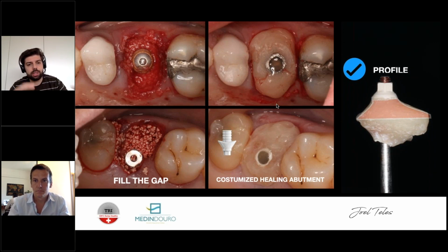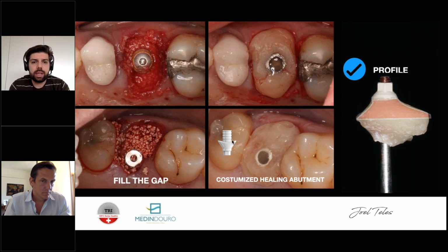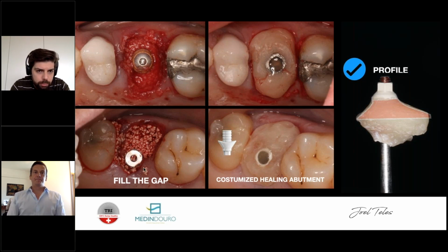Normally, due to the consistency of it, what I do is pick up the provisional abutment, either PEEK or titanium in the molar region. If it is an esthetic zone, it will always be PEEK. I'll screw it in place and start with big pieces of normal composite, and I will try to recreate all of these contacts directly before the grafts. I recreate this with big pieces of composite, and afterwards with flow I fill up the rest.